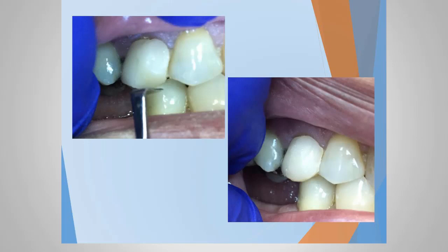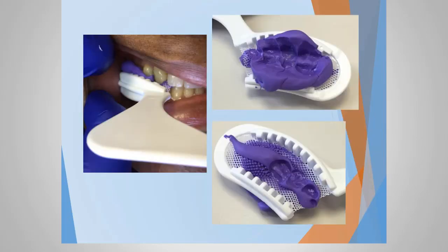So what we did was we removed some of that old composite and placed new composite there, again not bonding it, but just to give it some shape and some form that it didn't have before, as you can see here in this picture. Light cured it, made it hard, took an impression with a triple tray. Buccal margins kind of washed out a little bit, and this is the opposing arch.